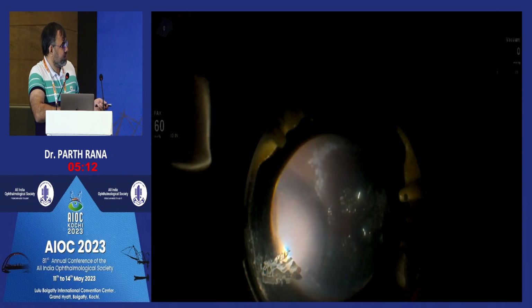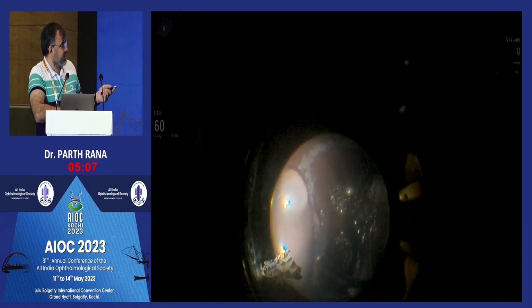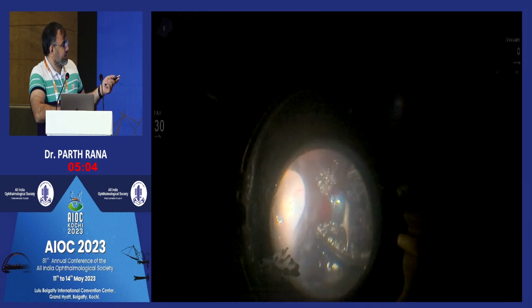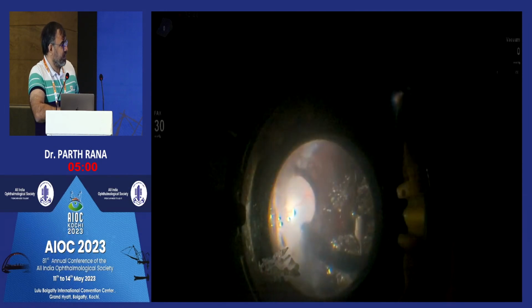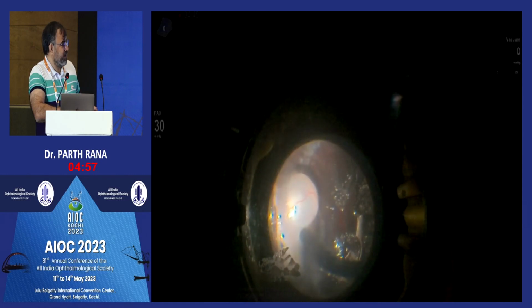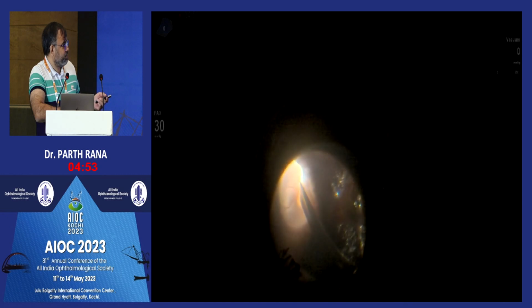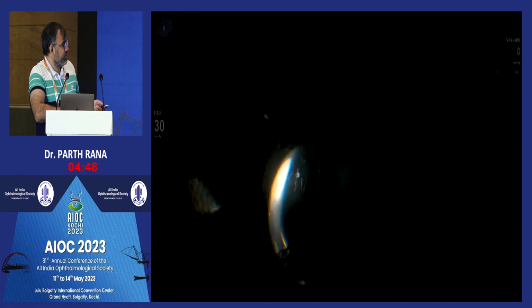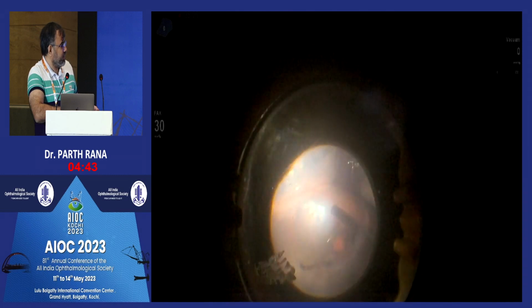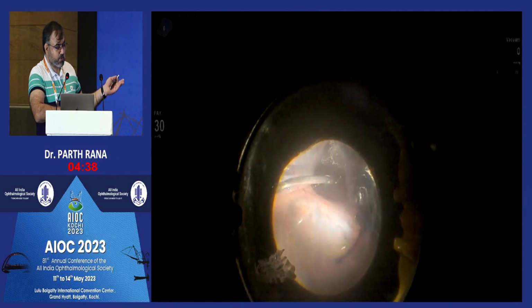As we can see here, I saw some of the retinal dialysis at this part, and suddenly, as I am seeing here, due to the infusion upside there was a bubble below the retina, and it was a kind of bad day going on. I felt I should do everything clearly, and I tried to push this bubble out from the same retinal dialysis. And as I was trying to do that, suddenly I pushed it like that. Actually, it's a 3D video, so here it was not seen, but on another part it was seen.